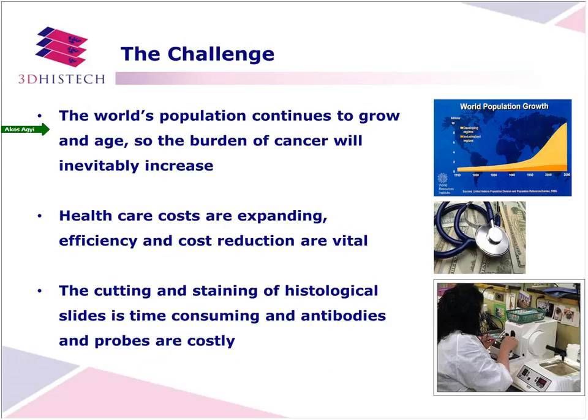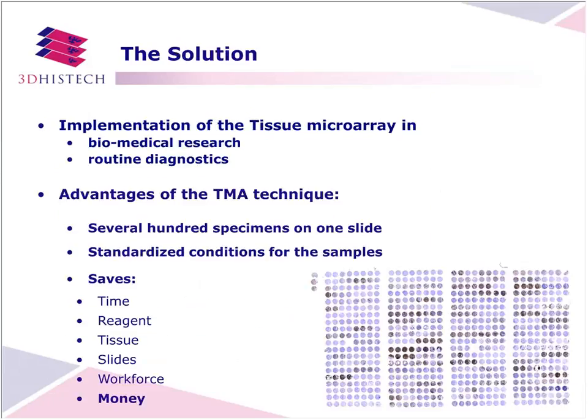The cutting and staining of histological slides is time-consuming, and antibodies and probes are costly. The solution to this challenge is the implementation of tissue microarray in biomedical research and in routine diagnostics.